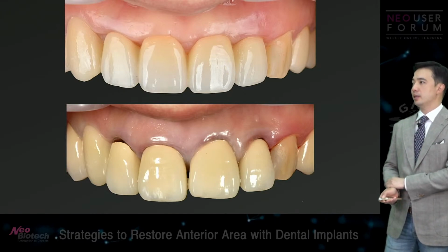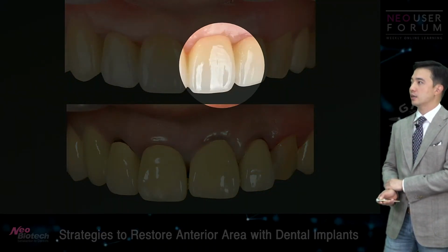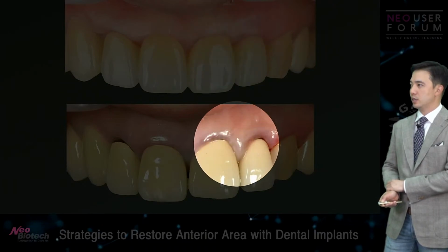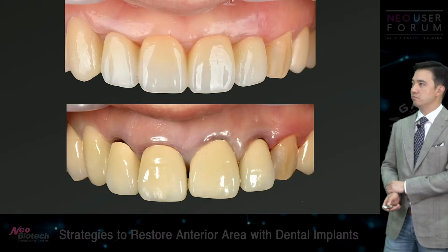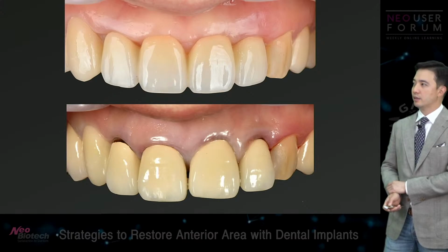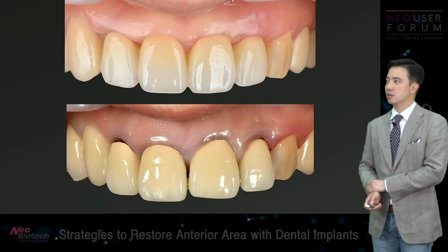Yeah, so the papilla, I did lose a little bit, I would say, compared to what I had, but I think I would say this is good enough.